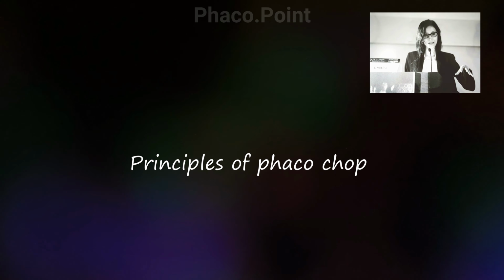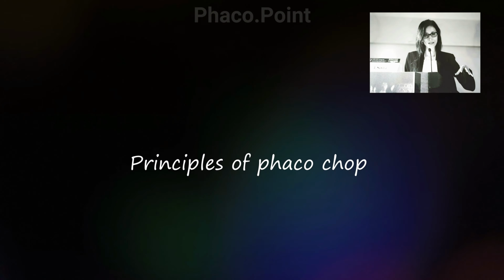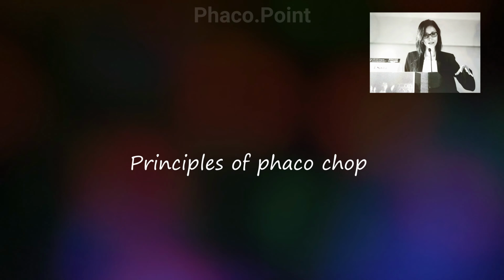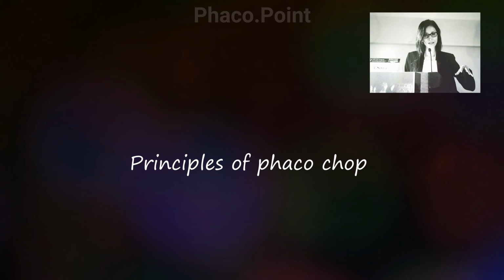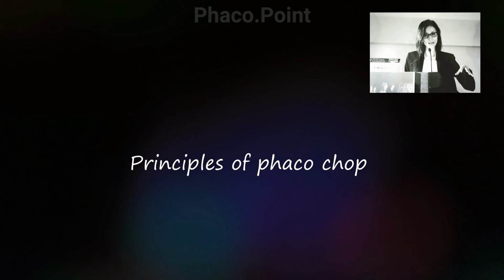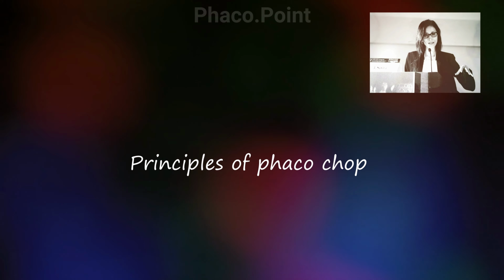The principle of chopping remains unchanged, whether you are doing a stop and chop wherein you have made a groove and divided the nucleus into two halves, but you're still going to use the same technique of chopping to break each hemi-nucleus into two halves. What I will try to demonstrate, and make easy for you all to learn, is how you get started, get going and get proficient in performing the direct chop technique.